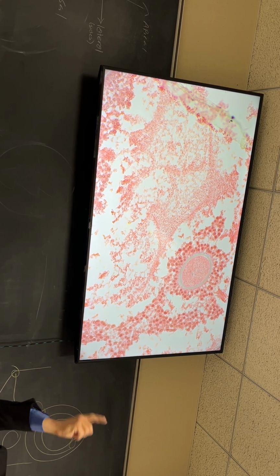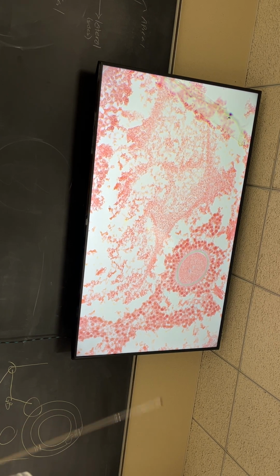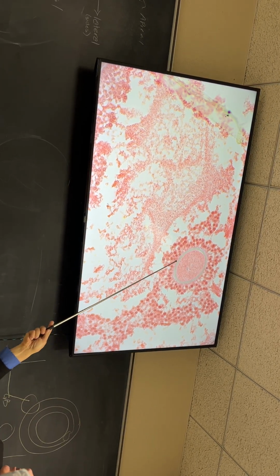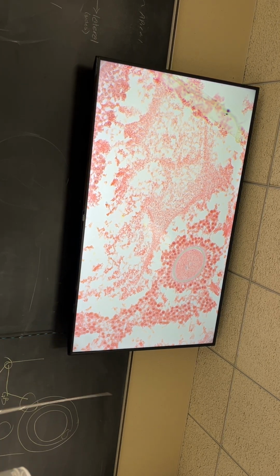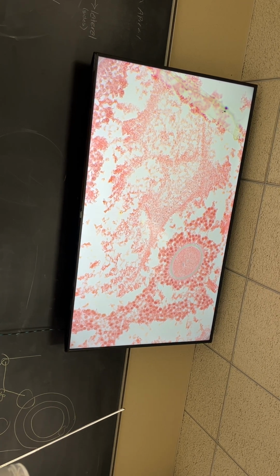Those words are very weird, and this is the weird part of it, right? Corona radiata. What's corona mean? Other than beer, right? What does it mean? Like sun. Crown. Means crown or halo, ring. So we have 2 different things here, right? We have that kind of bluish circle, and then we have this ring of cells around it, right? So one of those is the corona radiata.